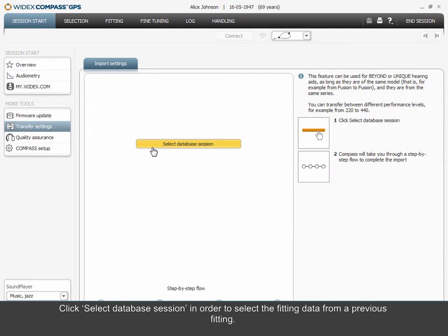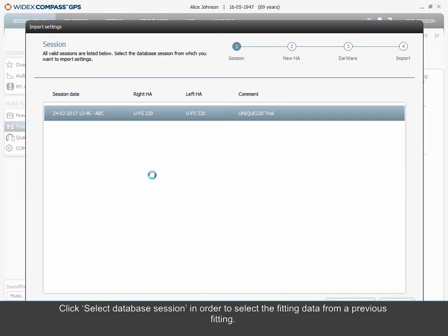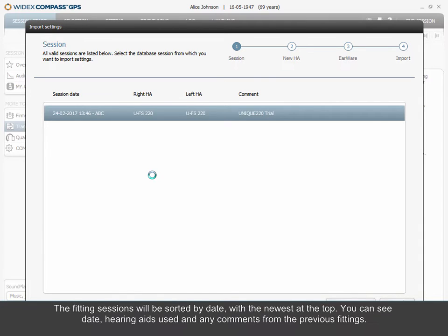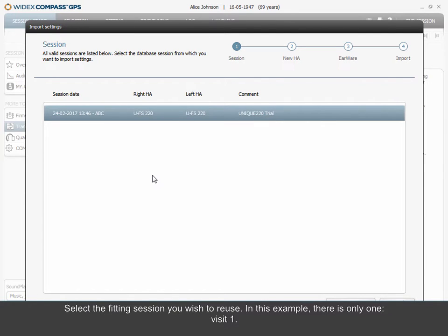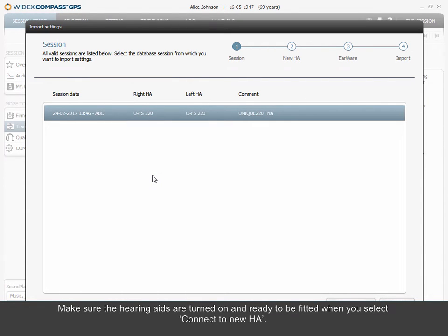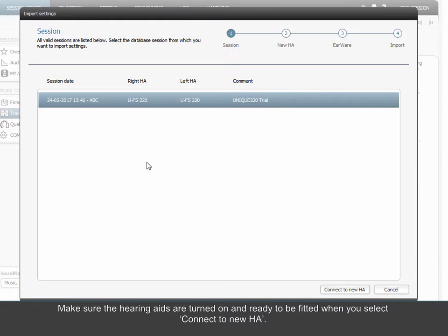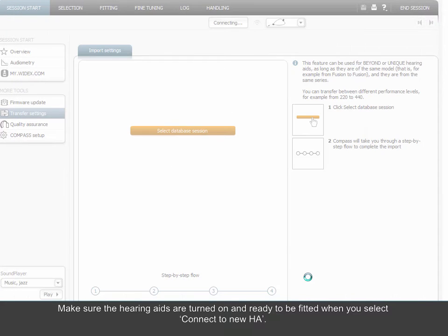Click Select Database Session in order to select the fitting data from a previous fitting. The fitting sessions will be sorted by date, with the newest at the top. You can see date, hearing aids used, and any comments from the previous fittings. Select the fitting session you wish to reuse. In this example, there is only one: Visit 1.